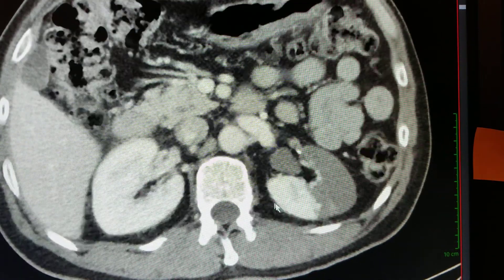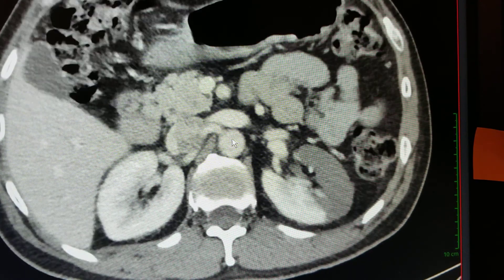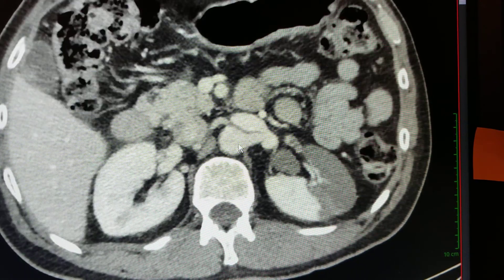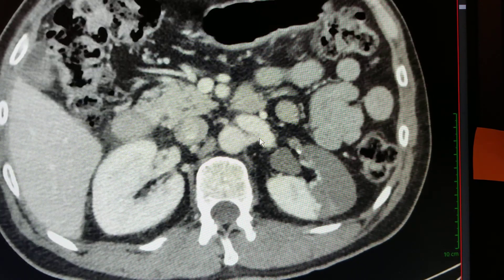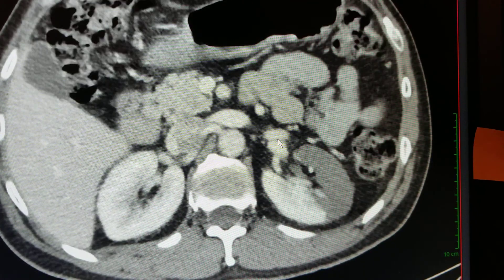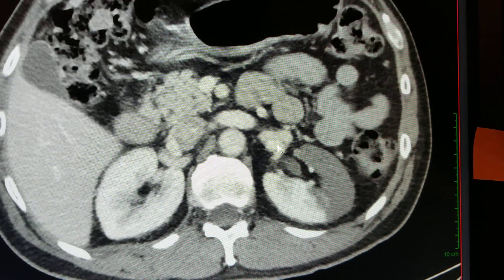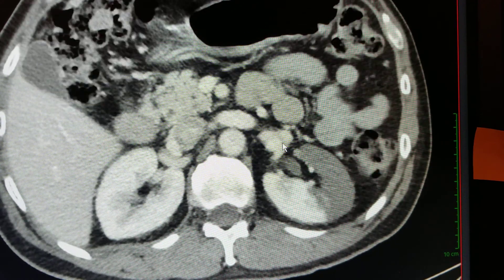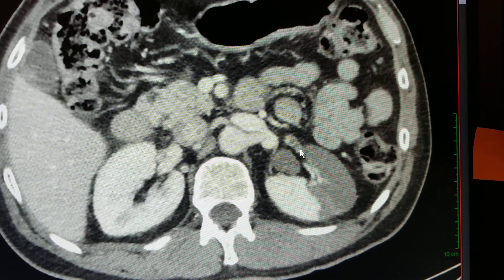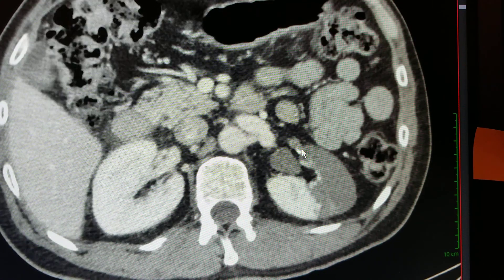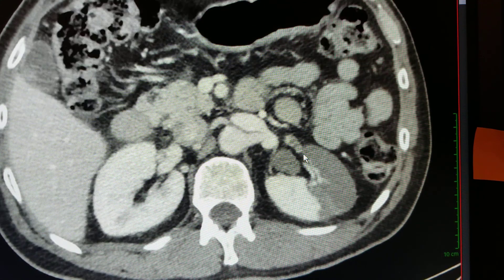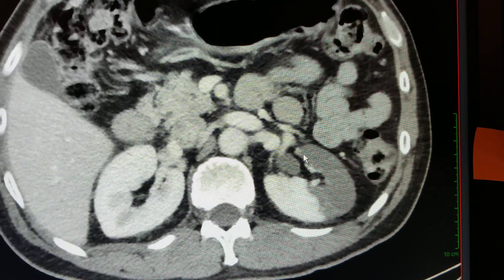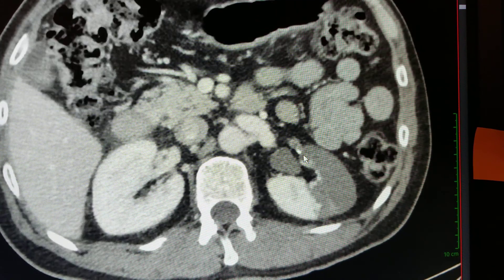Looking closely at the aorta, we can follow here the left renal artery. Following that along, here's the posterior branch, and then right here is the anterior branch. You can see this thrombus right in that anterior branch of the left renal artery.